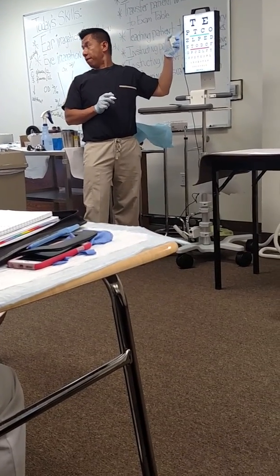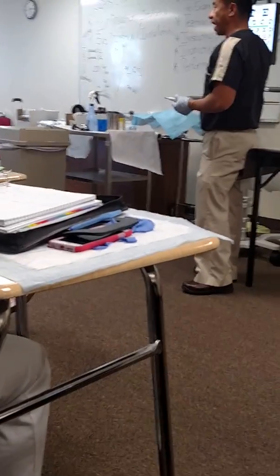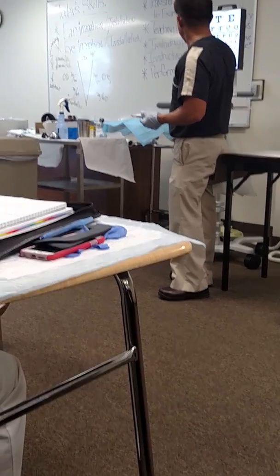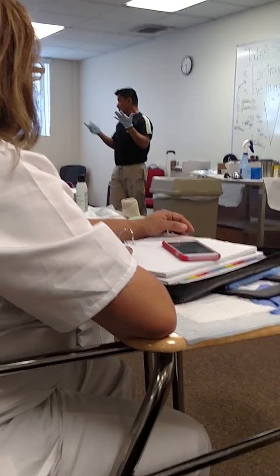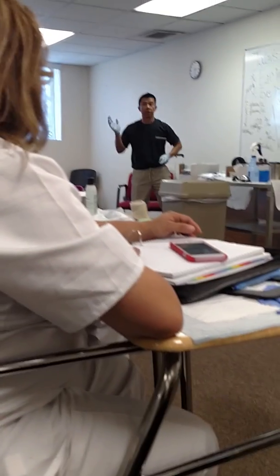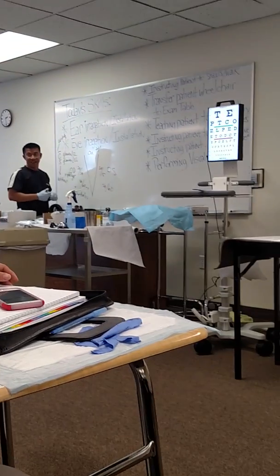So this is your measurement. What it means on the side, this is what the doctor is going to be basing your vision on. At 20 feet with no pinhole, with both eyes and no occluder, go ahead and read the whole thing. With 20/20 or 20/15, yes? F, B, C, D, T, Z, L, E.